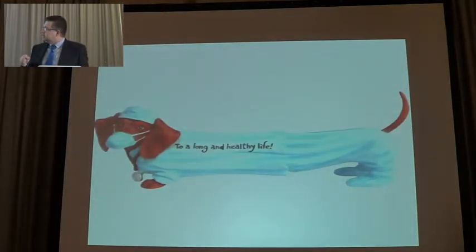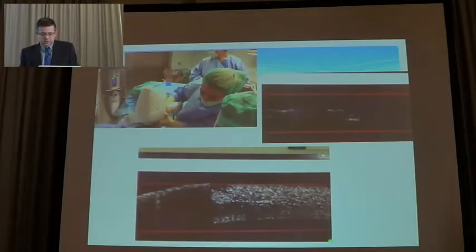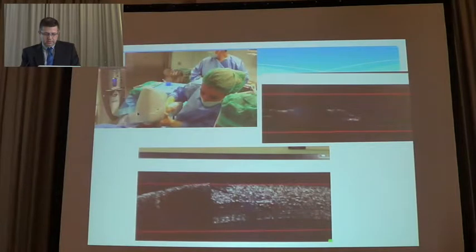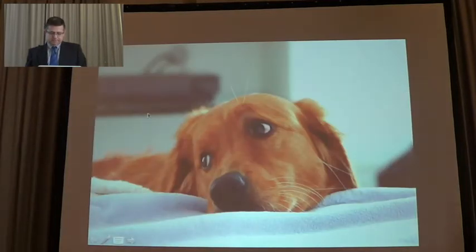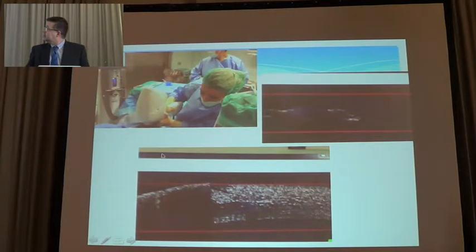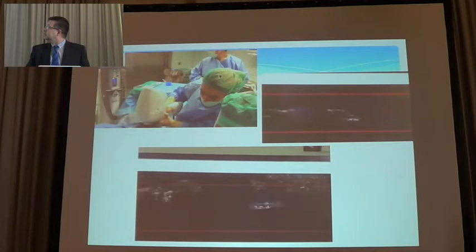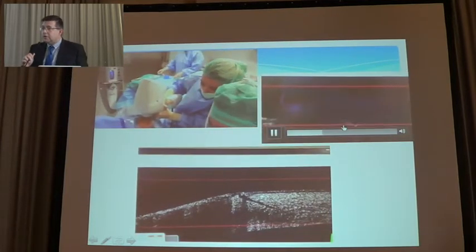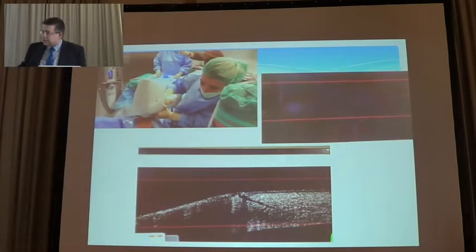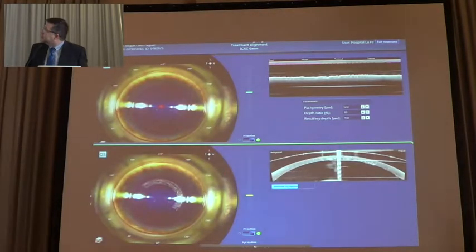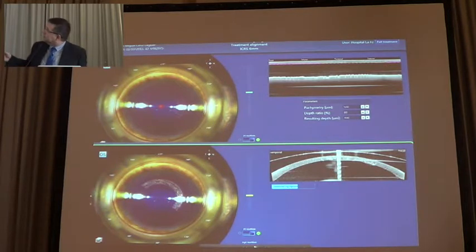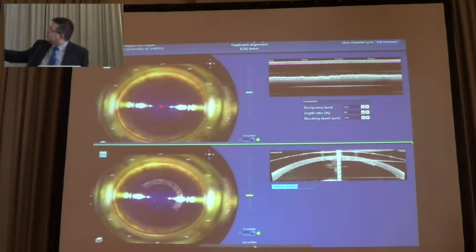Sometimes, getting the OCT to the surgical theater is not so easy. At the beginning, when you get your OCT, it's not straightforward — even if you only want to see how a wound incision looks in your cornea. But sometimes it becomes easier, as you can see here when we are doing the tunnel for an intracorneal ring: with the system we can see where we will place the tunnel and whether we are too deep or too shallow, and we can modify it.